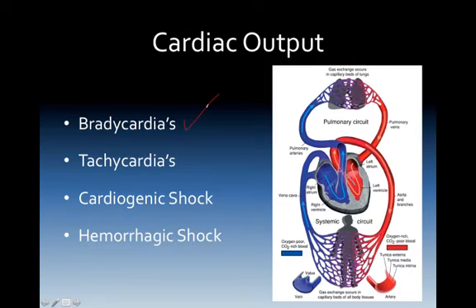In tachycardias, consider an SVT or VTAC with a normal end-tidal CO2. This would suggest that the patient is tolerating the tachycardia okay. But in the normotensive patient, if end-tidal CO2 is decreasing, it states poor perfusion. So we could actually see them going into an unstable tachycardia. In cardiogenic shock, trending end-tidal CO2 with lower CO2 levels may indicate a perfusion problem and be one of the earliest signs of us understanding that the person is going into a pump-related shock.